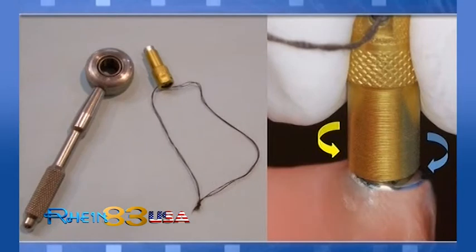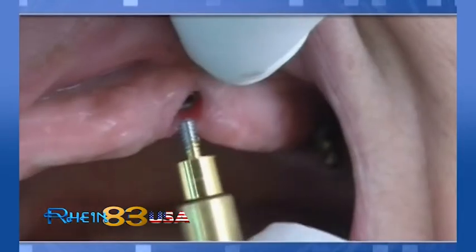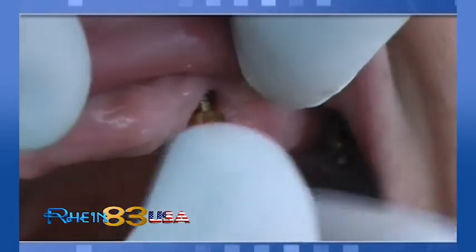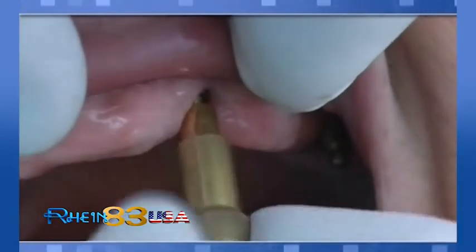When screwing the new abutments into implant threads, always tighten manually and then unscrew first, repeating this procedure at least three to four times in order to adapt the implant thread to receive the new abutment screw. The abutment screw is adjusted in this way to the implant thread without use of any additional tool, with very good stability.